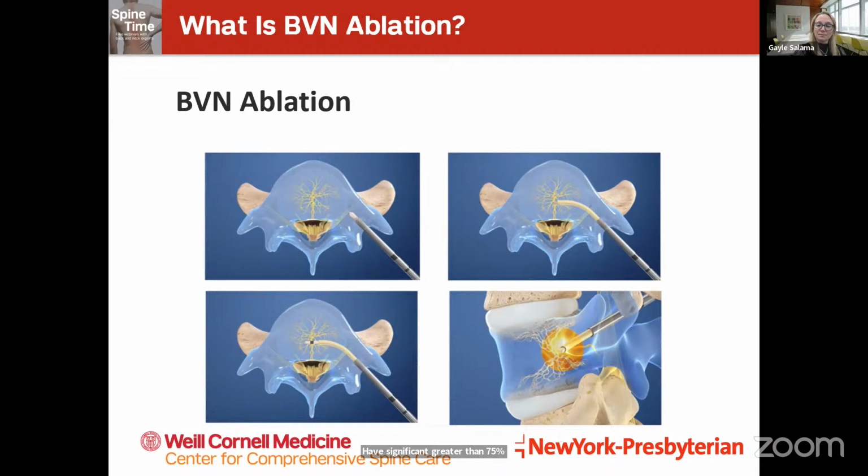Got it. So a few questions about specifics that might be contraindications. For my longstanding patient and friend, Rita, she has a nasty scoliosis curve. Is scoliosis something that's doable in this procedure? So scoliosis in and by itself is not a contraindication. We will always look at the imaging beforehand, and we're looking at a few things. First of all, not only the Modic changes that Dr. Salama mentioned, but also what is feasible from an access standpoint. So scoliosis in and by itself is not a contraindication.